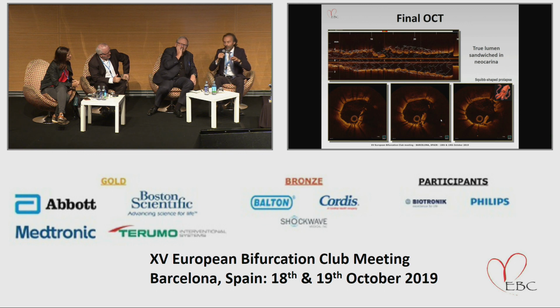If they are sure to be subintimal in the proximal LAD, they go retrograde, and then they put an extension catheter and recapture inside the LAD with the extension catheter. So they are sure that they are not involved. So this is the tip to learn from this. Yeah, that's a very good remark. Go antegrade, dissect, but not the circumflex, extension guiding, and re-enter.